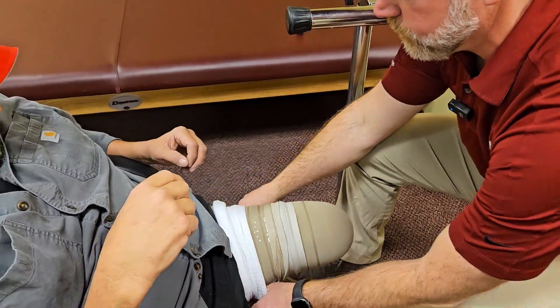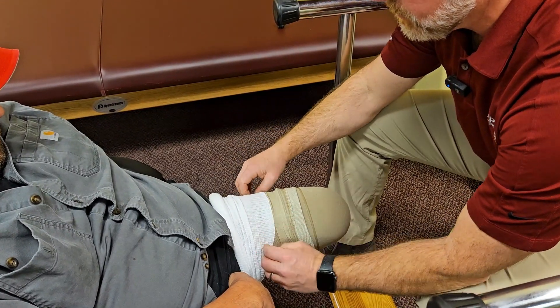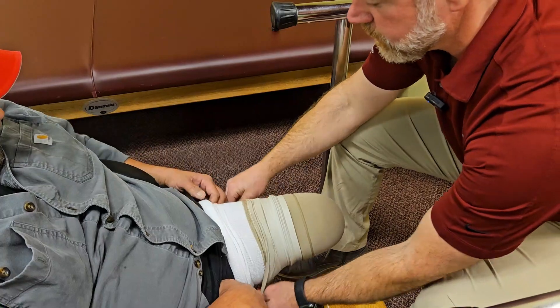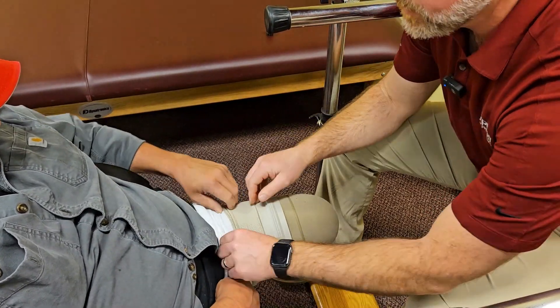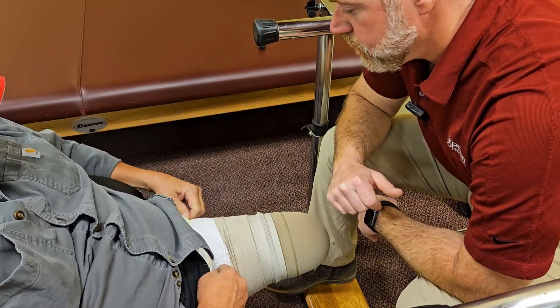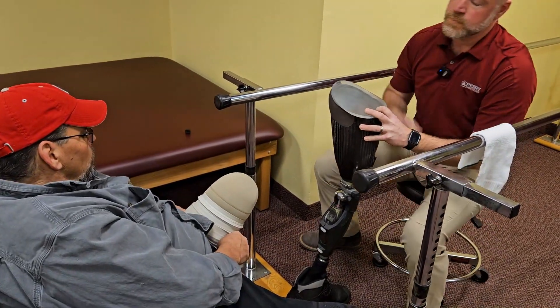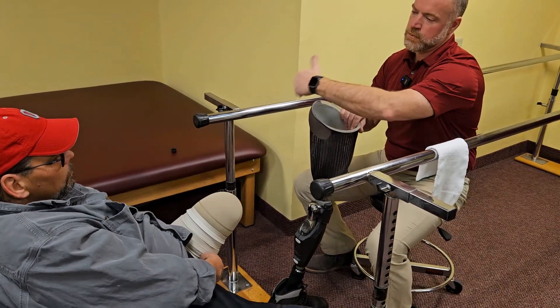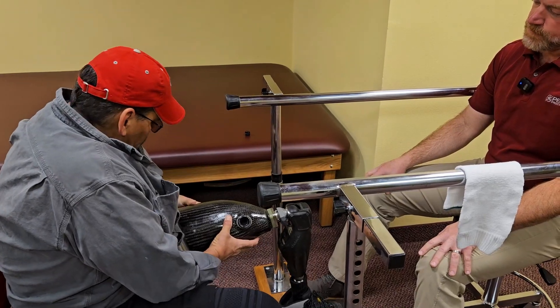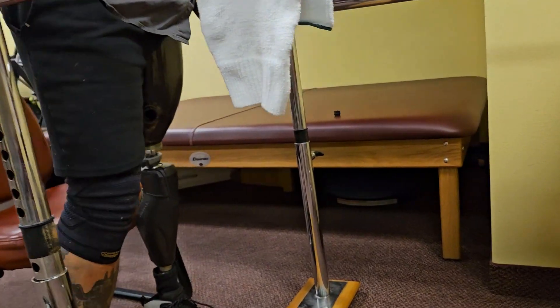When you put the sock on, make sure the fabric from the ring and the fabric from the sock does not go over the ring or the rubber part — otherwise it will not create any suspension. Take the end of the sock and put it all the way around down there, then fold it back over, pulling it up as high as you can and getting all the wrinkles out. As you put on the prosthesis and get farther down, it'll be a process of continuing to work the sock out over the edge of the prosthesis all the way around.